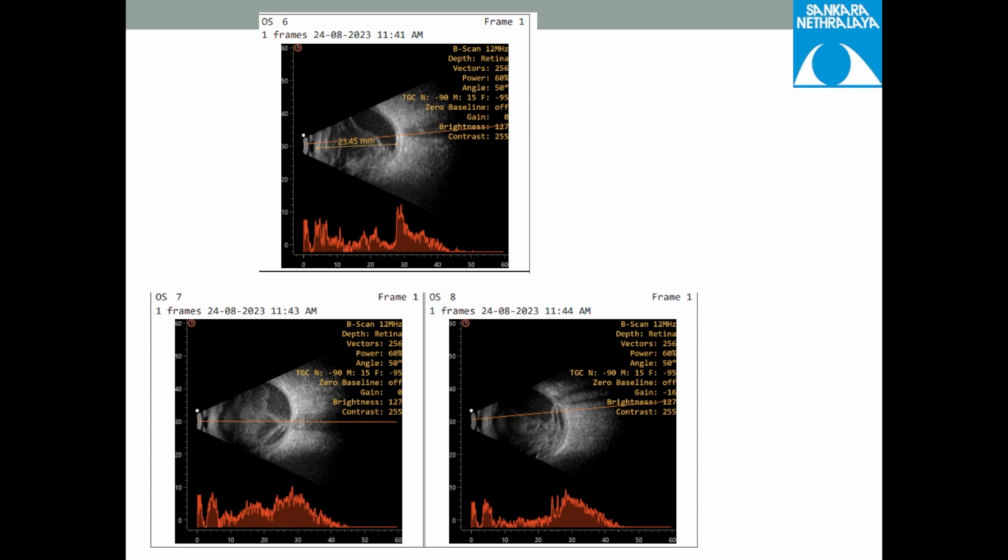They're specifically worried about the peripapillary choroidal thickness. I don't know why. So you'll have this specific, beautiful acronym next to that ultrasound report. They're very concerned about the peripapillary choroid. Around there, 2.2, like that. Okay. And what's the thickness of the sclera?